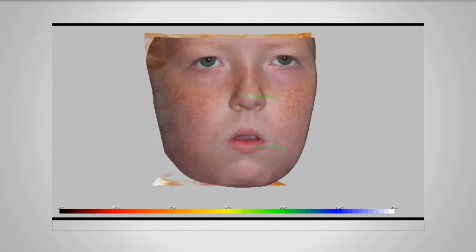Because just as we saw in those orthodontic surgery cases, as the face is brought forward surgically, those airways are improved. Well, what about the face during growth? If the face can grow forward, should we not expect the same kind of improvement in the airway? That's kind of an important parallel and important question. So let's look at case study number 1.